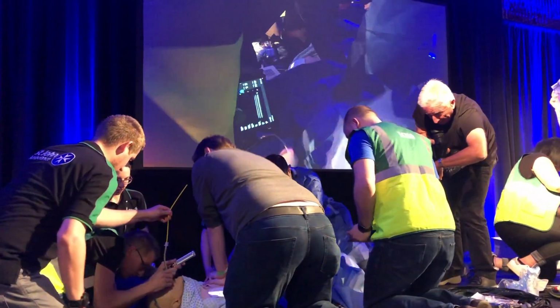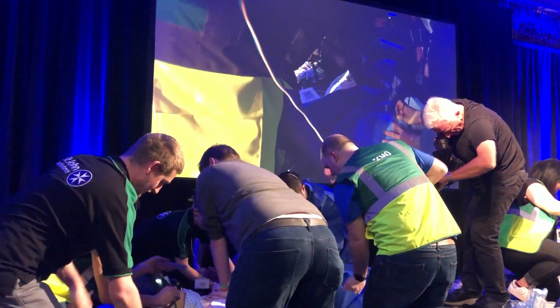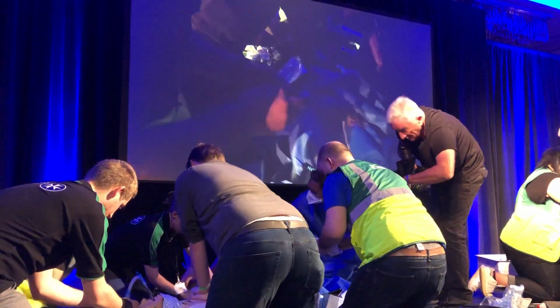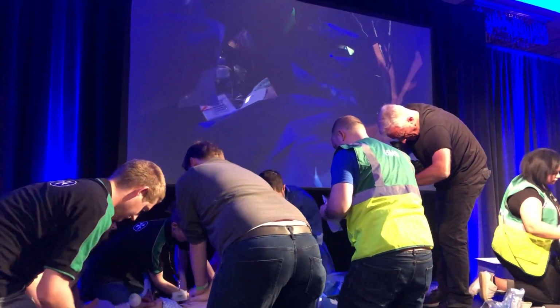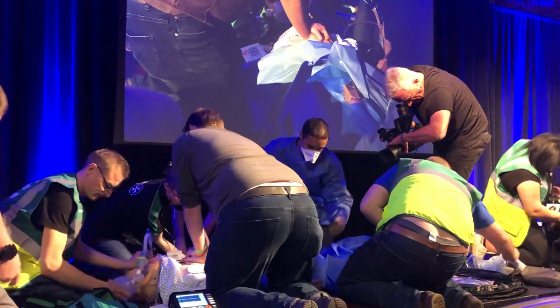Wires are very low morbidity in femoral vessels. Okay. They're not no morbidity, but if you've had a cardiac arrest, it's not going to be the biggest problem that day. Okay, so we're going to go straight to wires. It doesn't commit us to ECMO. And you may see wires going in, it doesn't mean the patient's going on to ECMO, and that's a really important point. But it's a crucial time-saving step for us.